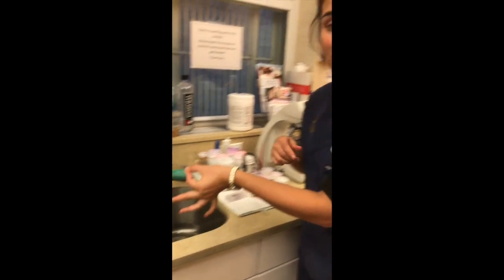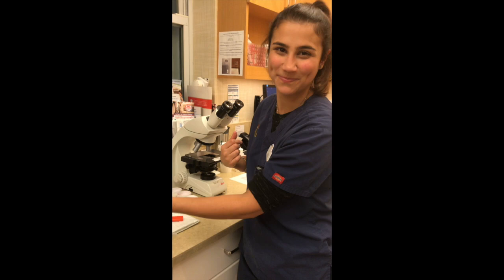Check. She left. And now we'll let this dry, and then we'll take a look under the microscope.